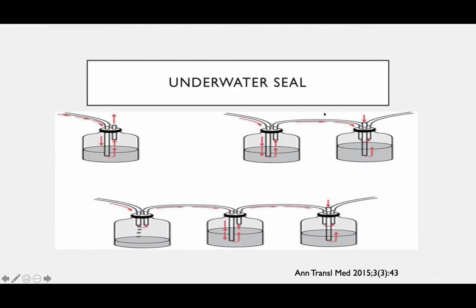Then after that, they developed the two-chamber system, where they added, excuse me, the suction compartment, which can help maintain the intrathoracic pressure at its normal level, which is usually minus 20, which is actually less than the atmospheric pressure.